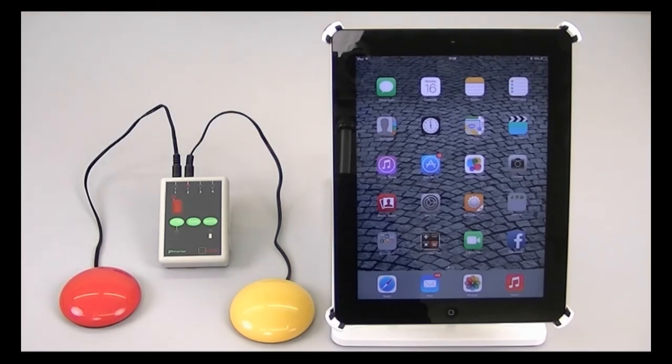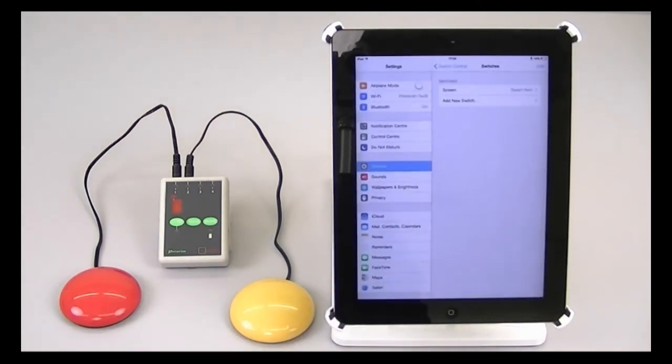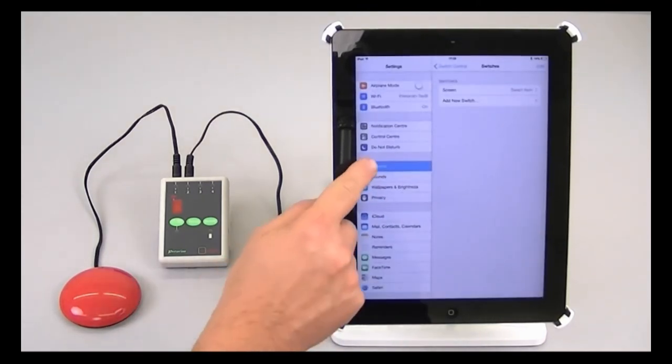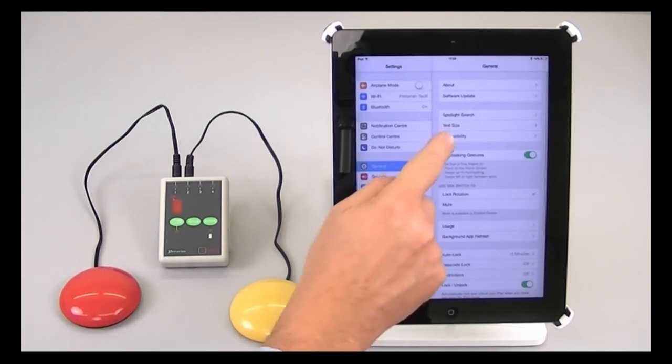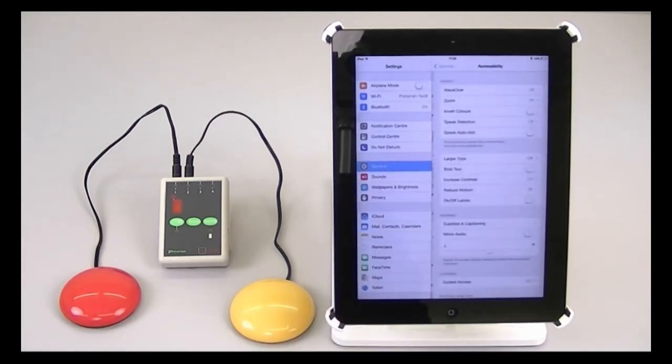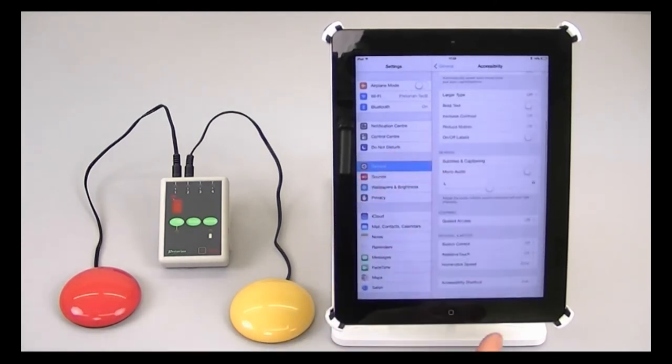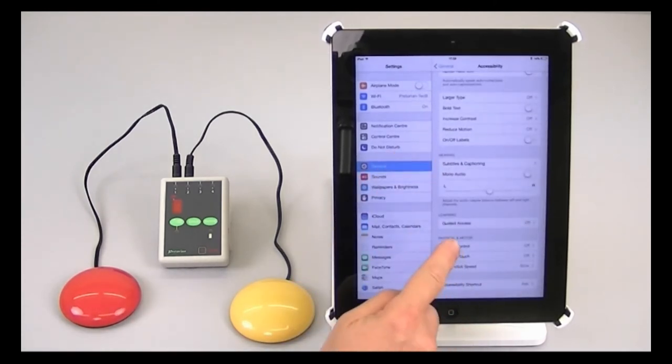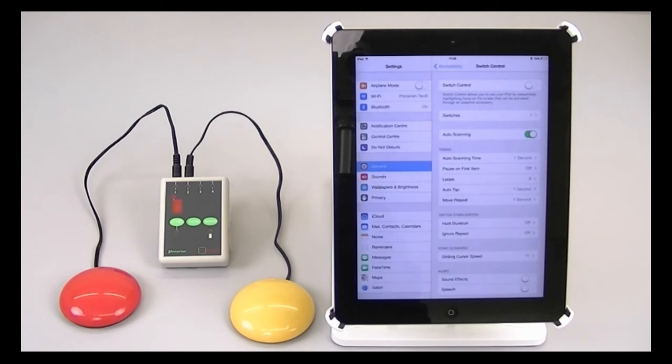So now turning to the iPad, I go to settings, general, accessibility, and then scroll down the page to switch control. The second item, switches, tells me how many switches have already been configured. At the moment it's showing one, which is the screen tap default, which is how iPad ships.